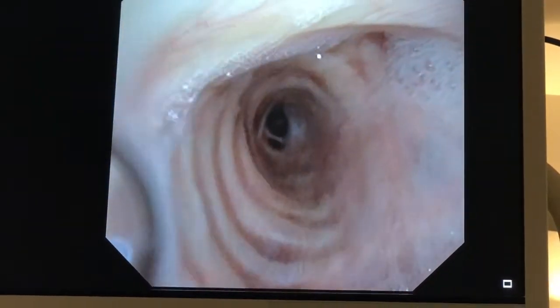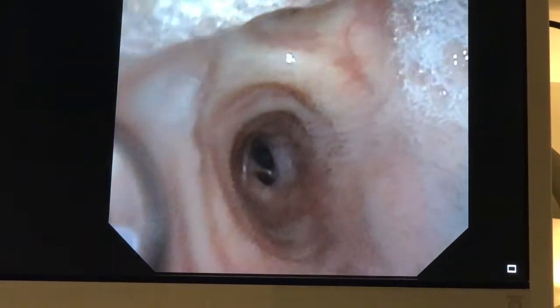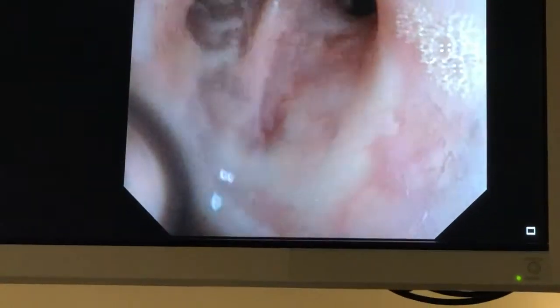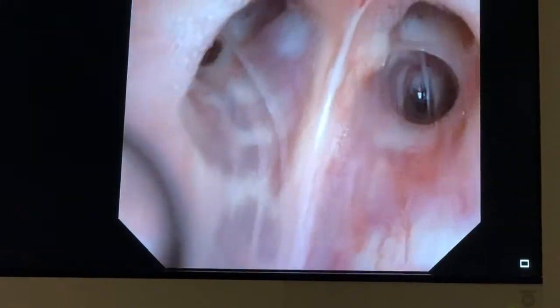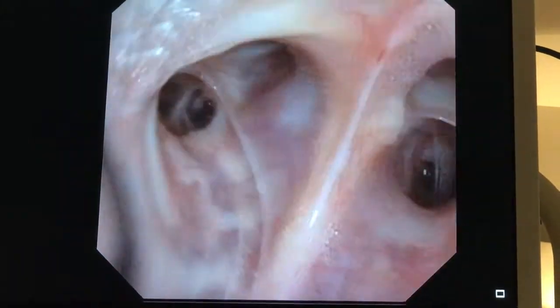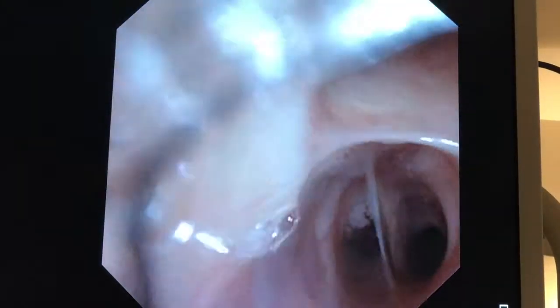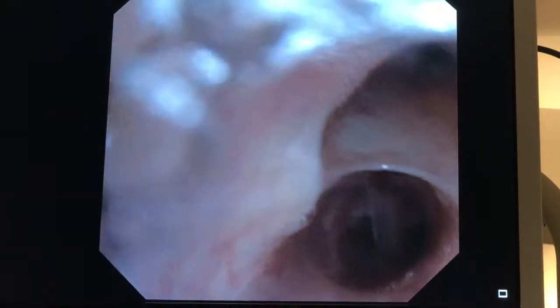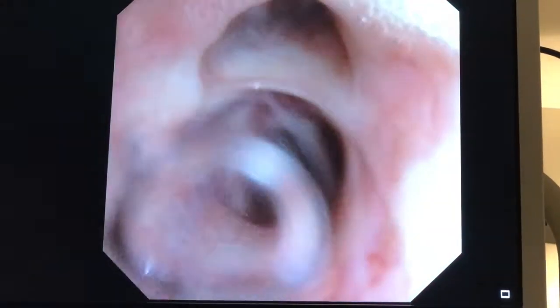Go across to the right main bronchus and look into the right upper lobe. There's the right upper lobe here, and it looks like these airways are clear, with no obvious endobronchial lesion there.